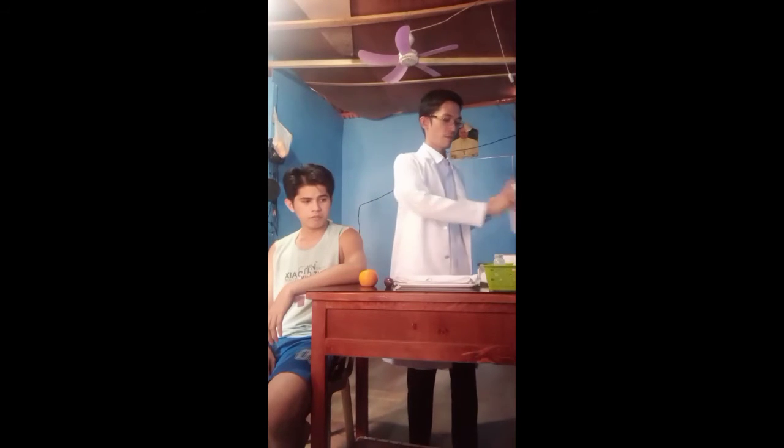Now, after preparing the oral medication and the parenteral medication, I'll be performing the administering of injections. So first is to do the hand hygiene. So I have here the alcohol, to ensure that medication is sterile and to avoid the transmission of microorganisms.